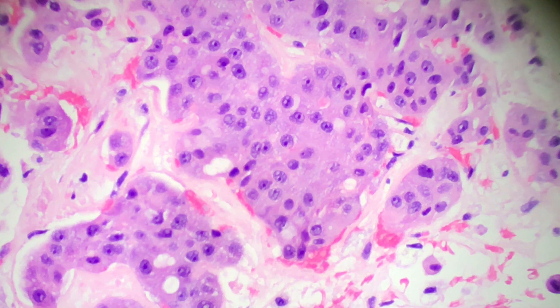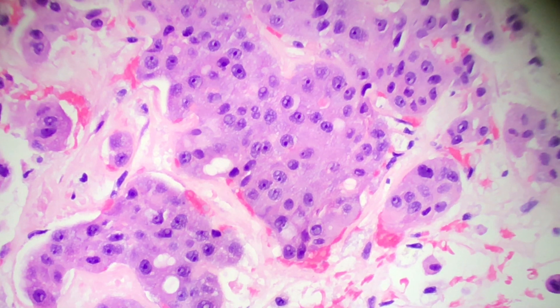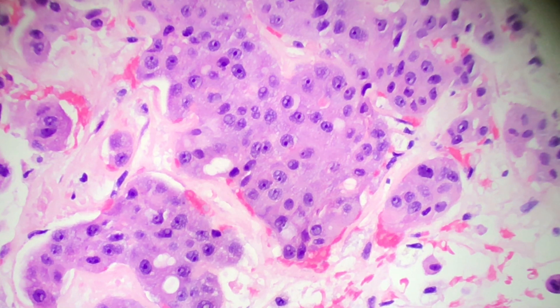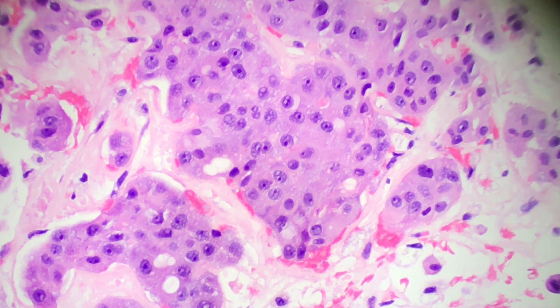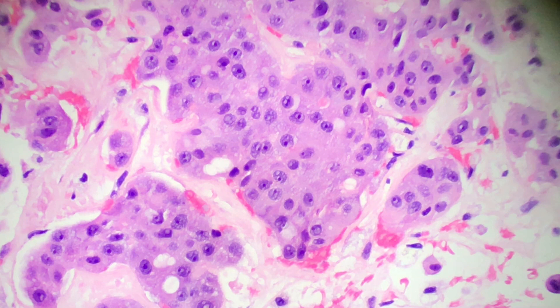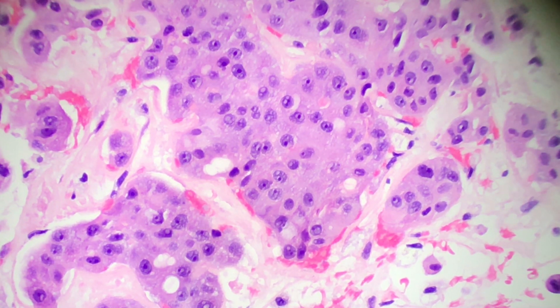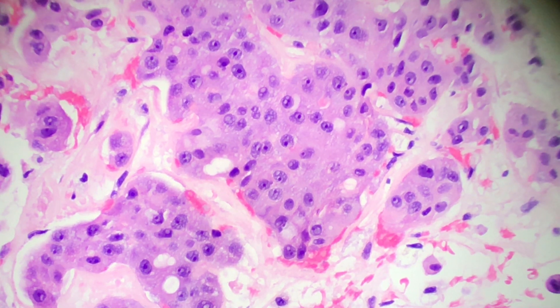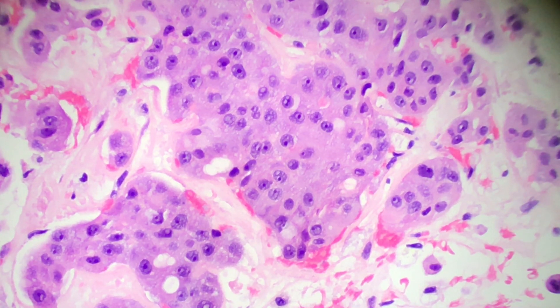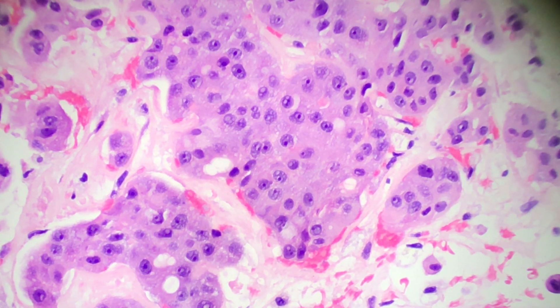Just a bit of a close-up view, so you can really appreciate the macronucleoli. The slight or very fine vacuolization of the cytoplasm — maybe not as granular as we would necessarily expect. Although we can tell there are individual cells, maybe we would like things to be a little clearer in definition, more crisp cell outlines, which is what we normally see in these lesions. This could be a caveat because this is a metastatic lesion, so that's something to keep in mind.